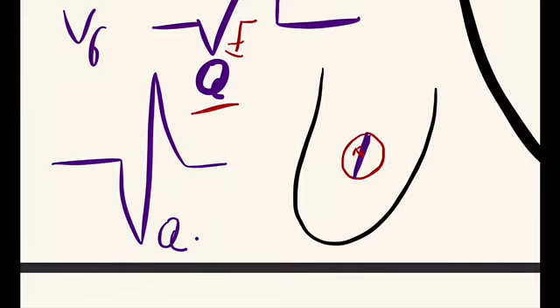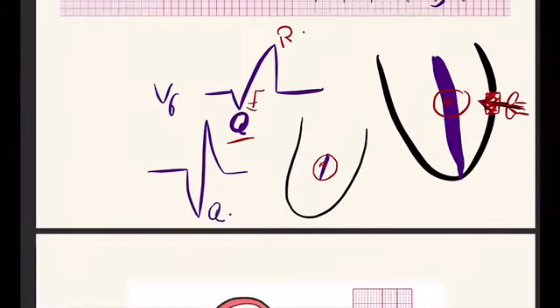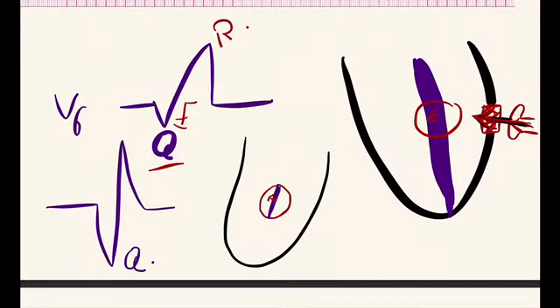Now with this, let me discuss one more important concept, that is the ST segment. You have heard the term STEMI. STEMI is ST segment elevation myocardial infarction. So a myocardial infarction which shows ST segment elevation is called STEMI.